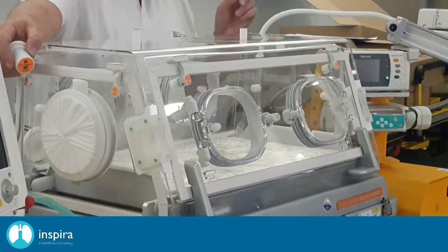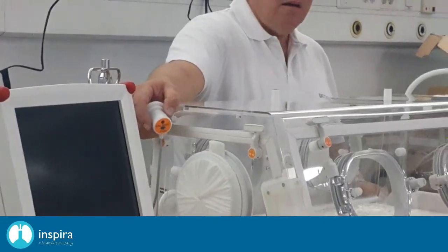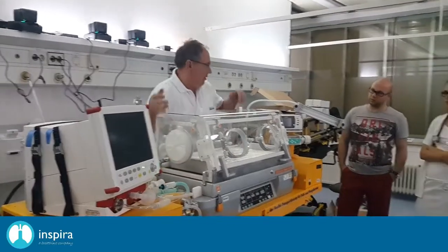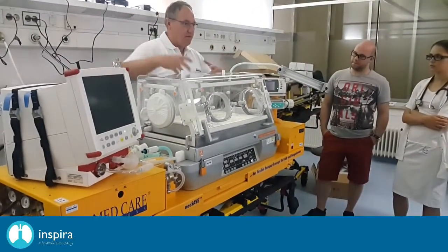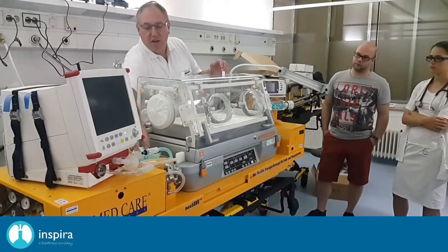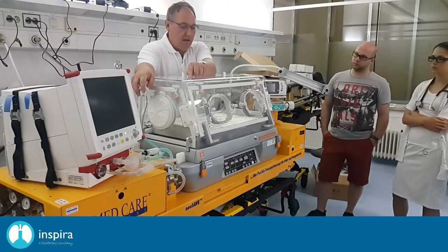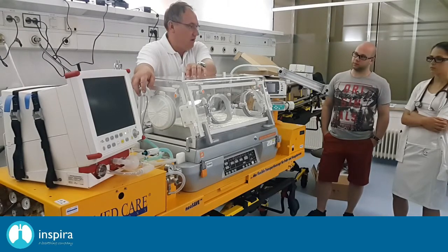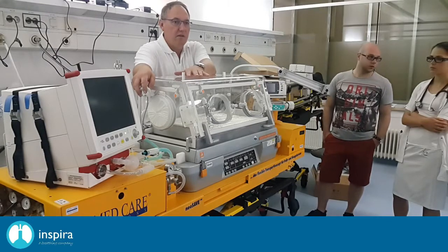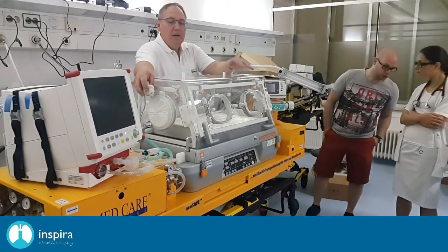For this purpose, you have two options. You have to make a connection from here, either to the flow meter here, you know, this normal pipelines, this green or whatever you use for oxygen therapy. You can connect it, and then you can bring inside the incubator 100% of oxygen to insufflate the baby. I don't know if you do that still. We do that very, very seldom, only in Germany.